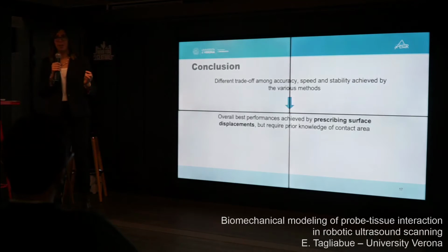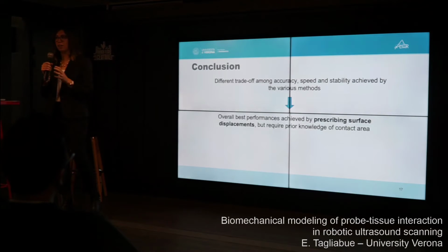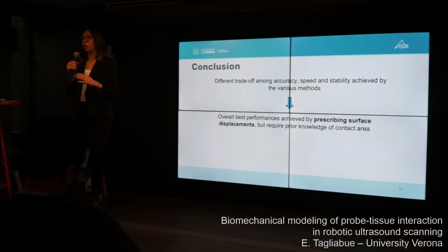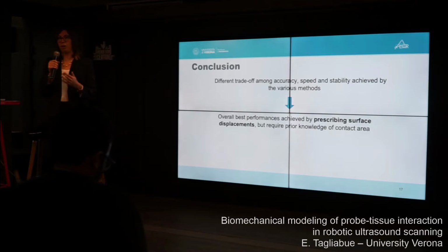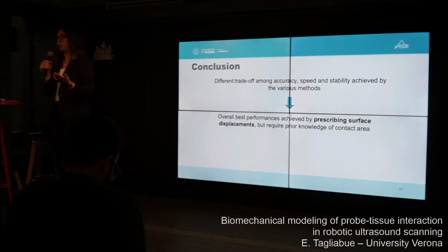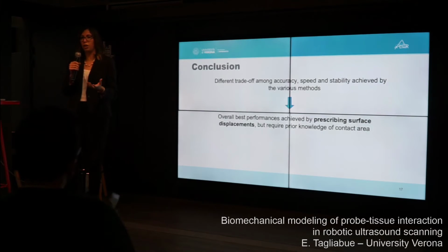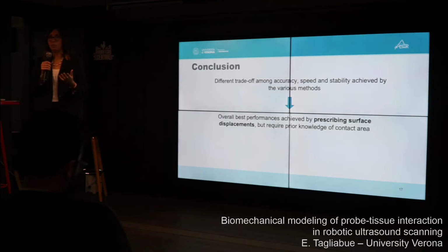So from this comparison work, it emerged that the different methods have achieved different trade-offs between accuracy, stability, and computation time, and also from a generalization capability point of view. And the choice of the method really depends on what is required by the simulation.